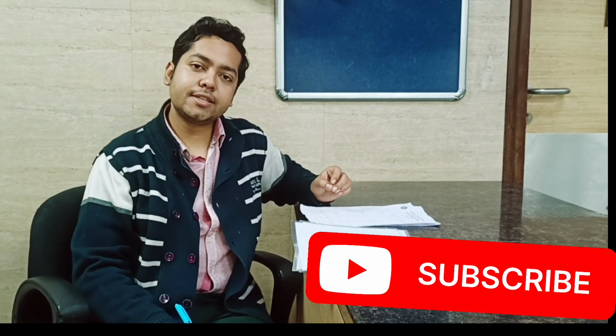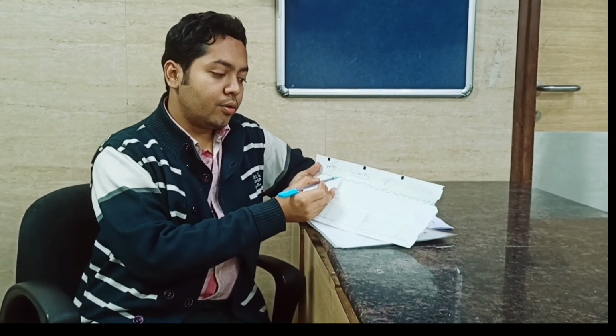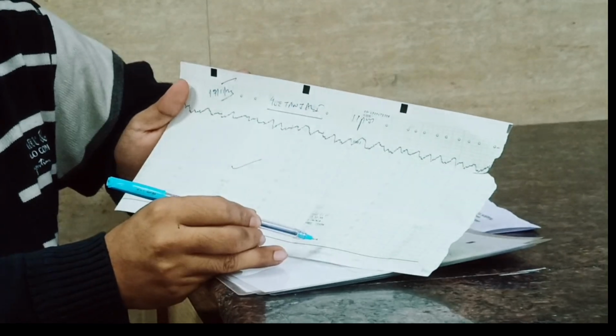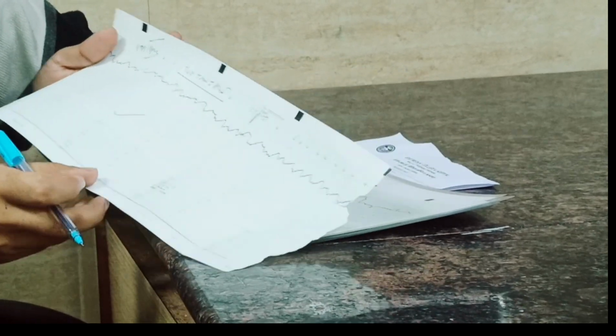Hello friends, in today's episode we'll be talking about CTG, cardiotocogram, or NST, non-stress test. Now the difference between non-stress test and CTG, let me tell you once again. Non-stress test is when only the fetal heart tracings are taken, but there is no obvious cardiotocography, that is, you are not taking tracings of the uterine contractions.